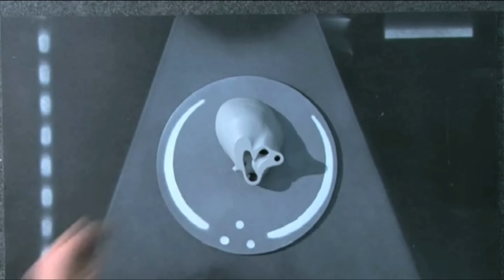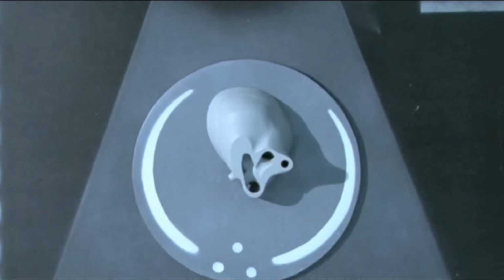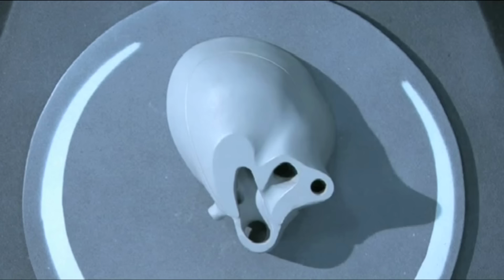Again, moving a fraction up towards the baby's head, you then start to see the aortic arch. In the previous section, we saw the ductal arch run straight back into the descending aorta. Moving fractionally up, you still see the ductal arch, but as you come above the point where the right branch branches off, you then start to see the aortic arch come over the top of the right branch and head to exactly the same place that the ductal arch is. In other words, heading down into the descending aorta.